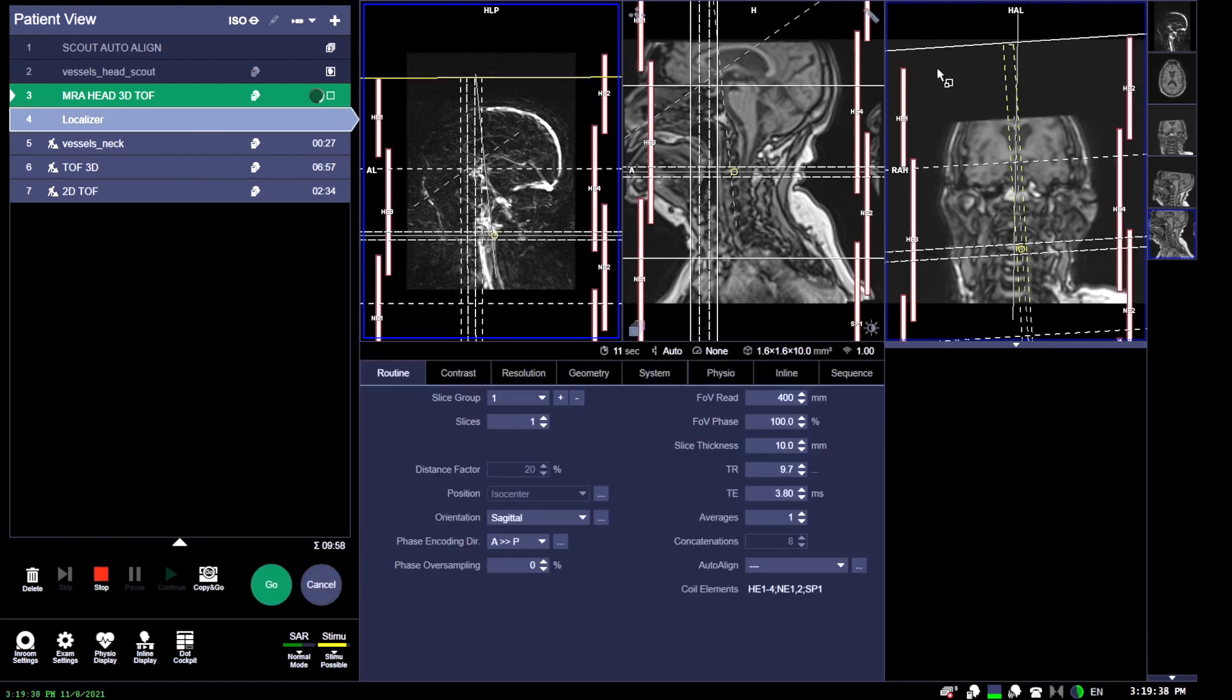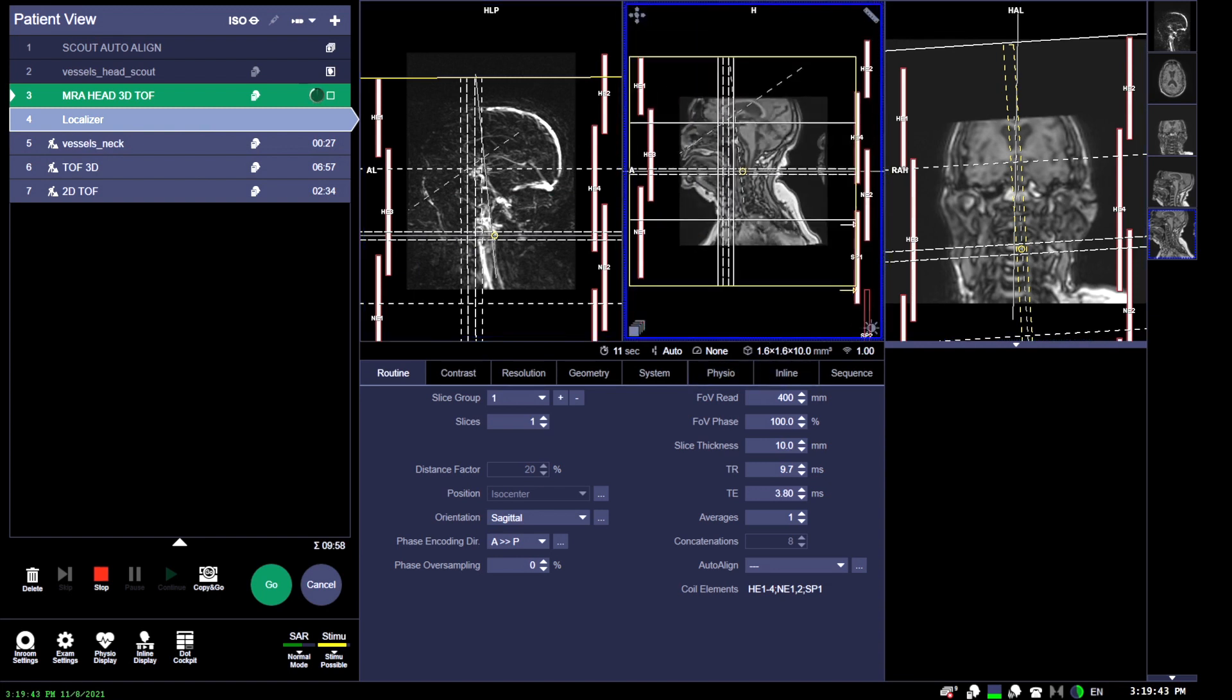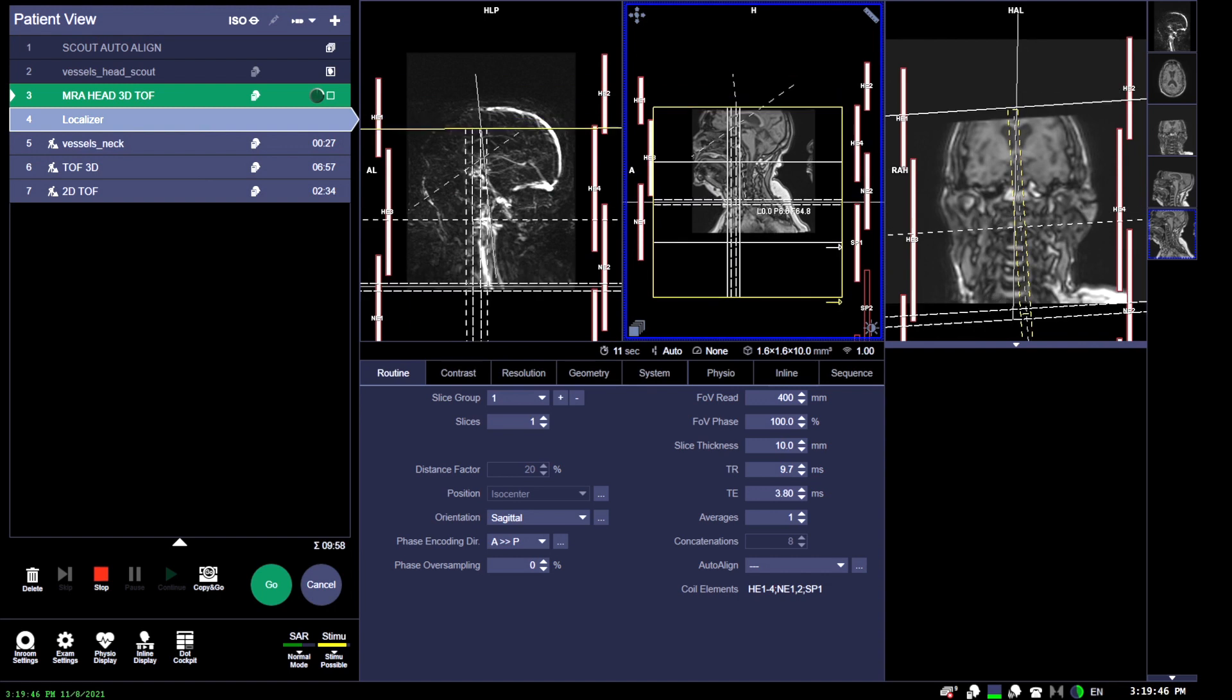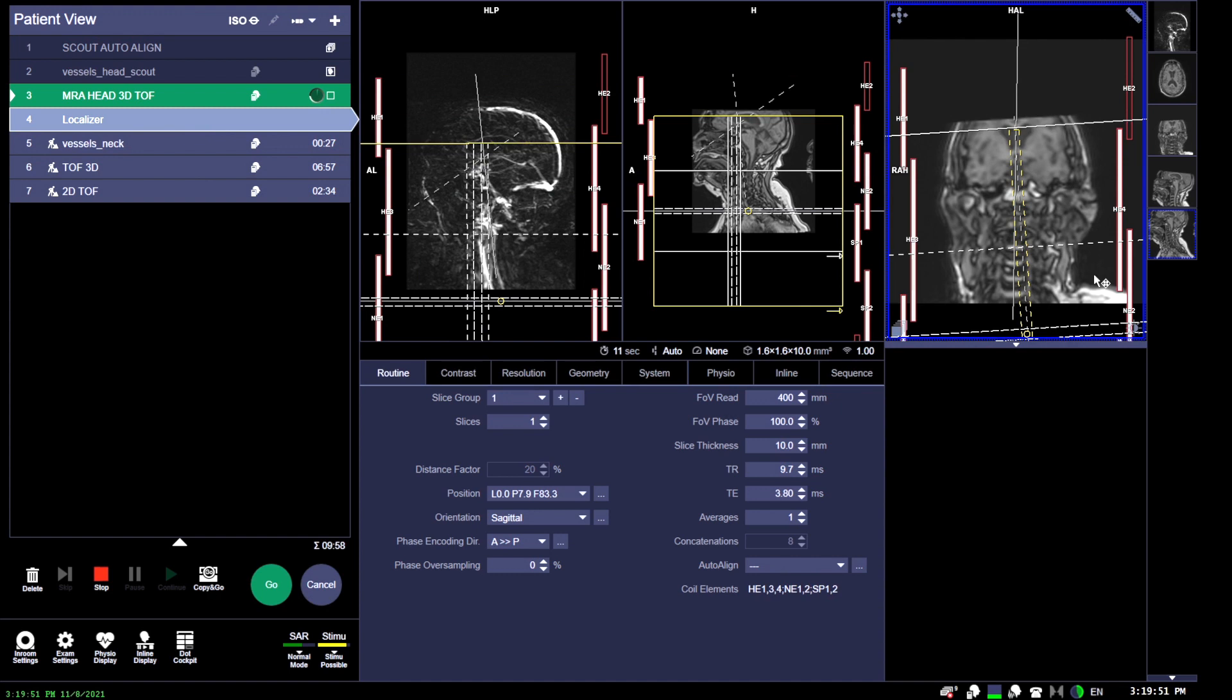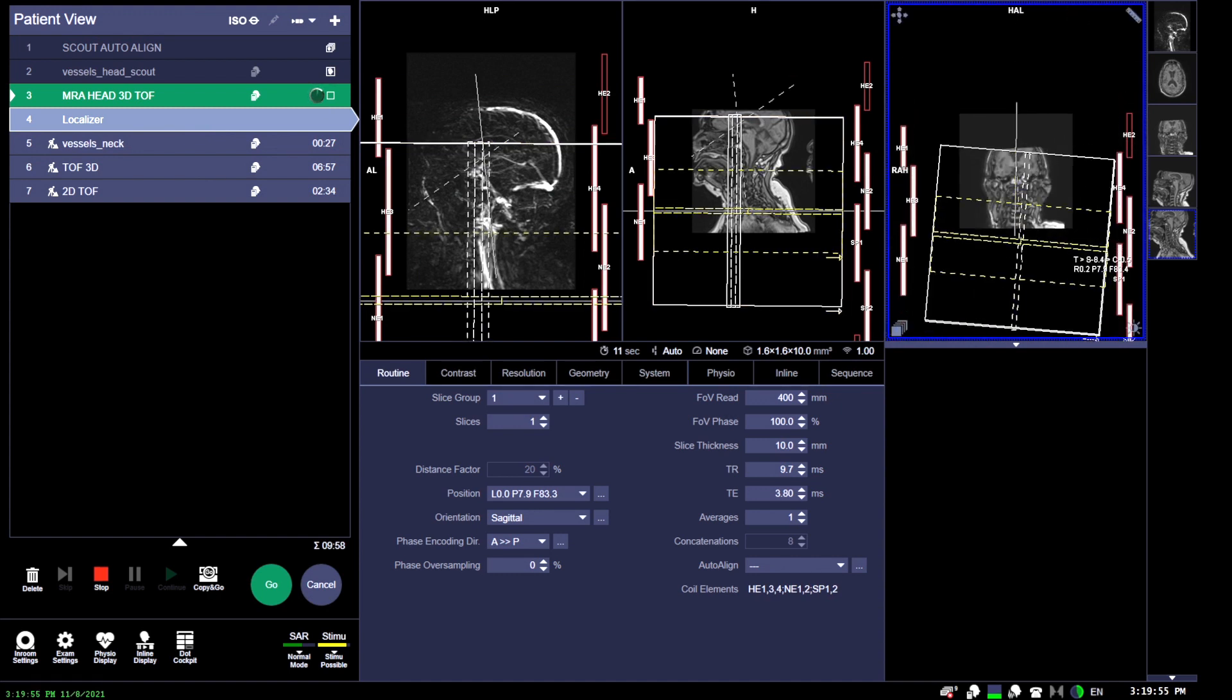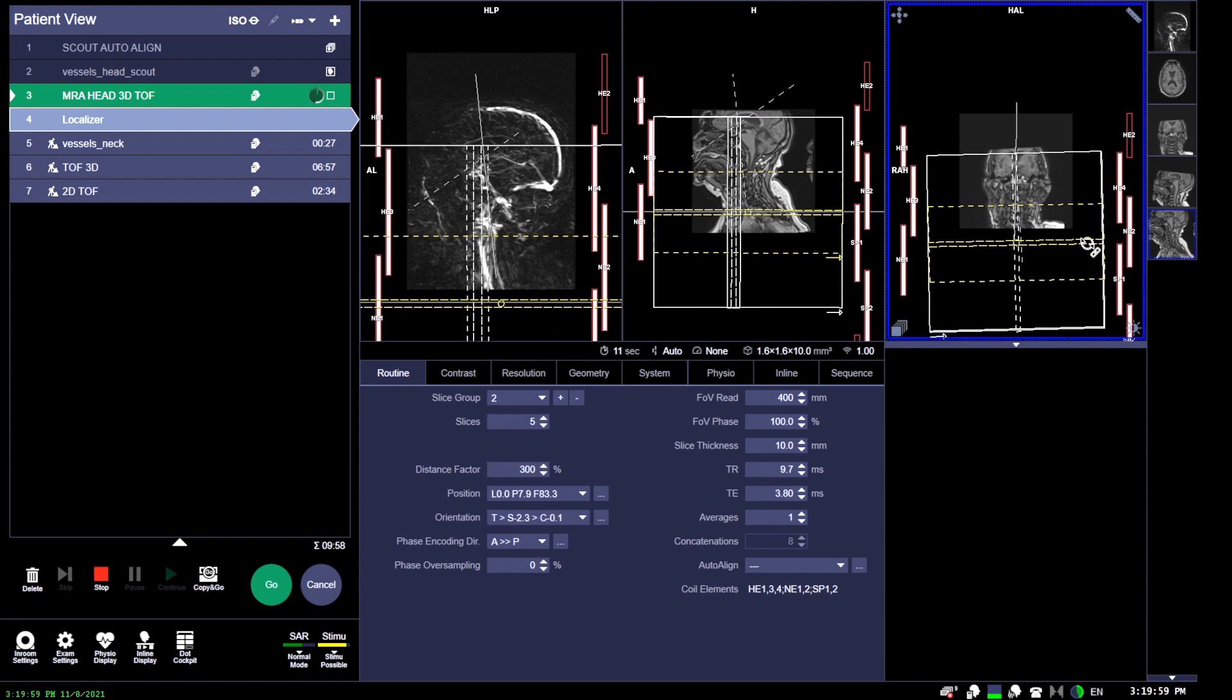You're going to do an axial 2D time-of-flight and plot your slices, like we said, straight between the inferior of the foramen magnum and then as superior as the dome of the corpus callosum.